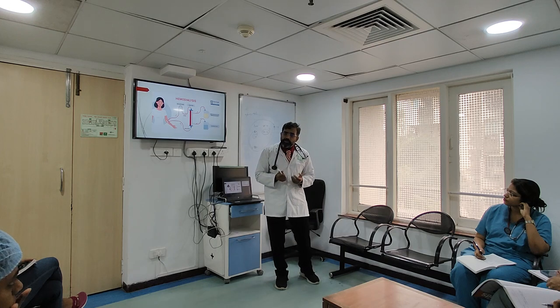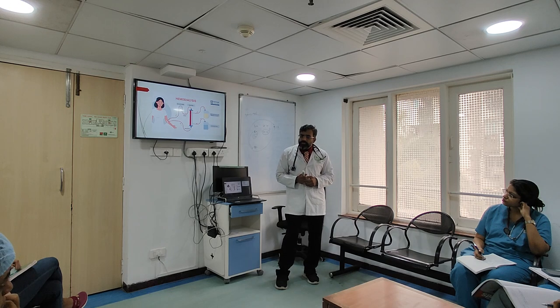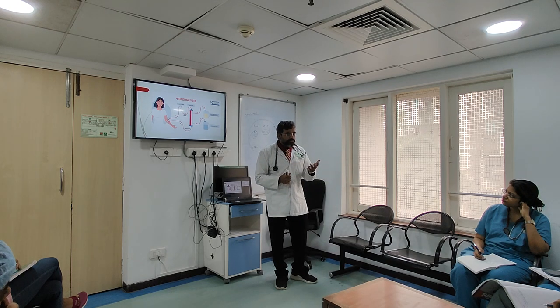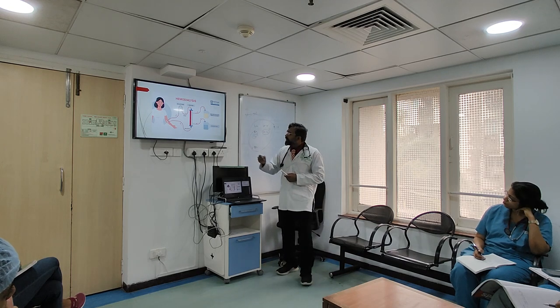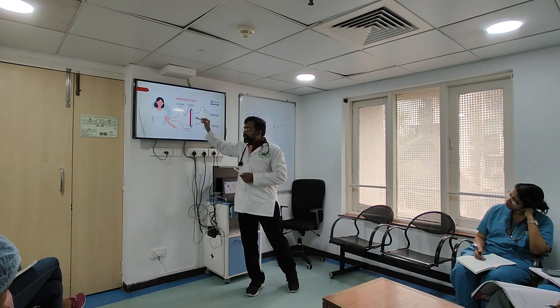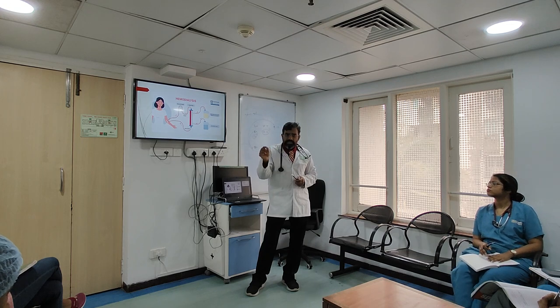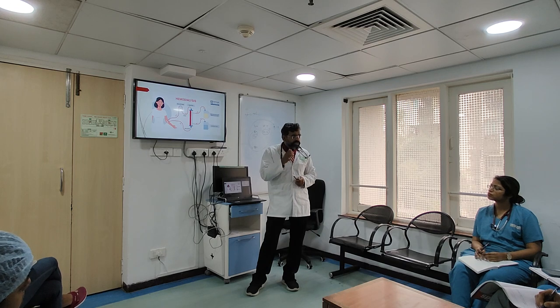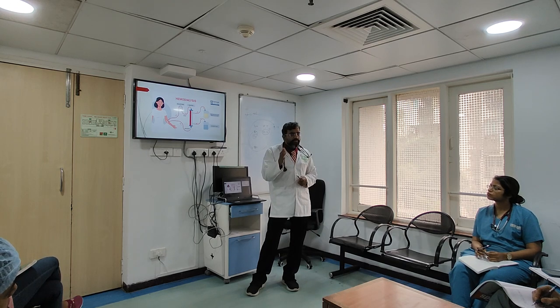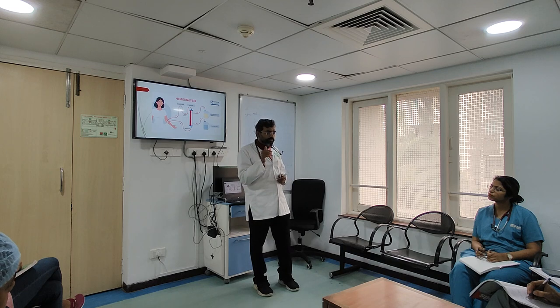No, here electrolytes are always going to get better only. Why is it going to get better? Because dialysate fluid has electrolytes similar to that of the plasma. The dialysate water is actually having electrolytes absolutely similar to that of plasma. In fact, it will always be better because these electrolytes can be altered. So obviously it can be better, but otherwise it is almost equivalent to that of the plasma. Clear on that? So electrolyte disturbances will not cause the patient to get hypotensive.